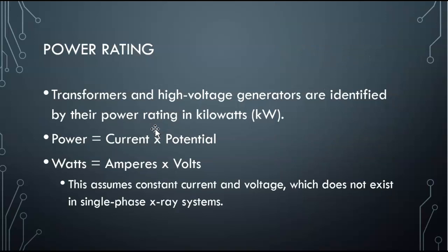All right, let's talk about power rating. Transformers and high voltage generators are identified by their power rating in kilowatts.